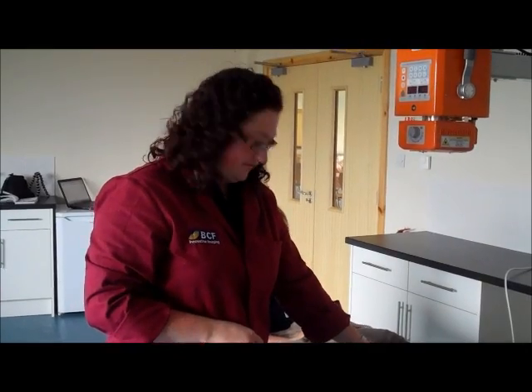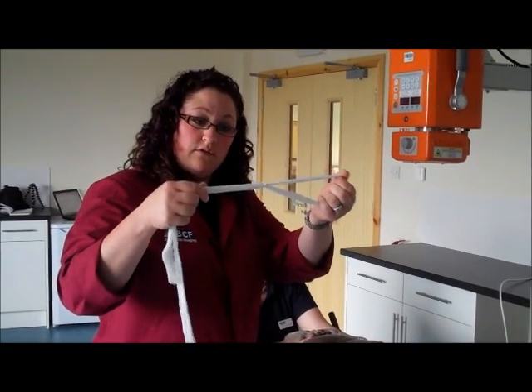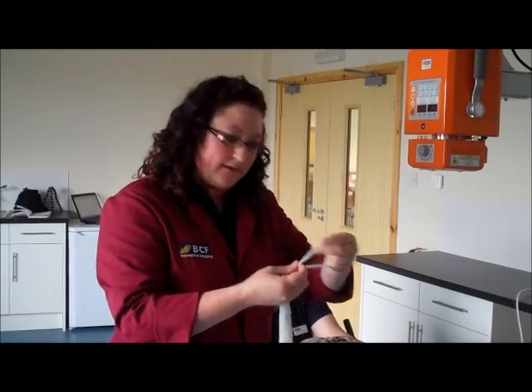What we need to do is ensure that we're in the correct position to be able to evaluate the hips and the coxofemoral joints and the pelvis on the radiograph. So the first thing we'll do is get the legs into position — place the restraint, whichever you choose to use, and place it around the legs.